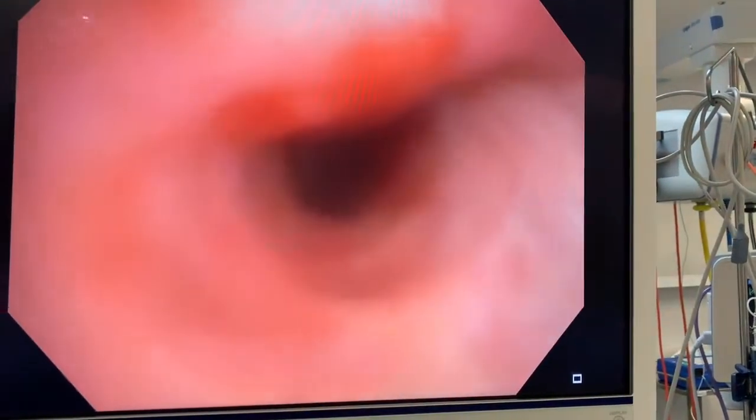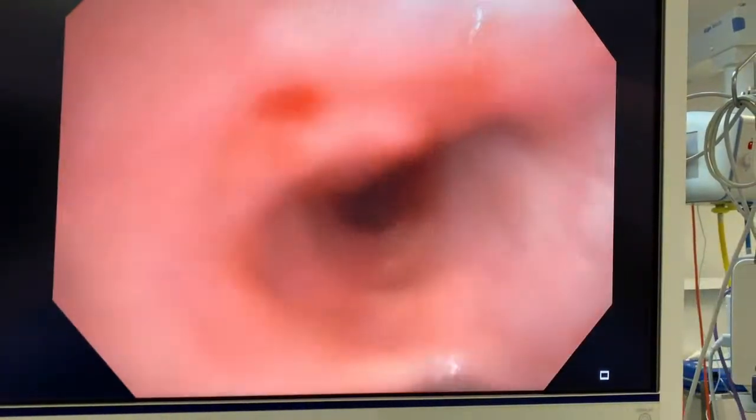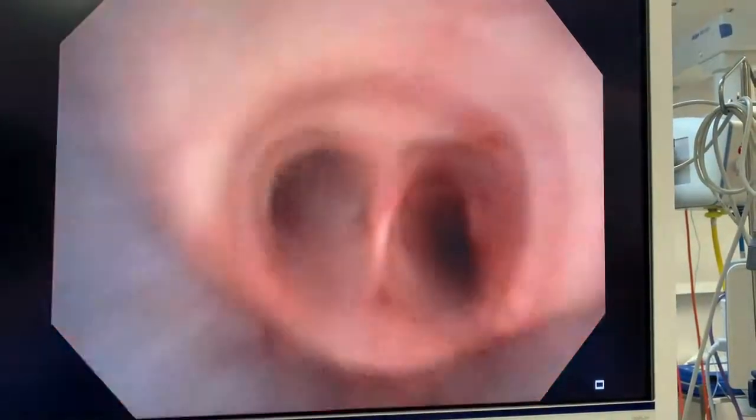With the flexible scope we can get more detail right around to the right upper lobe. You can see some blood there from the previous biopsy.